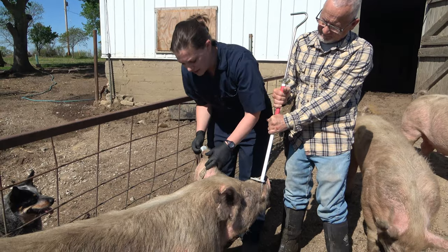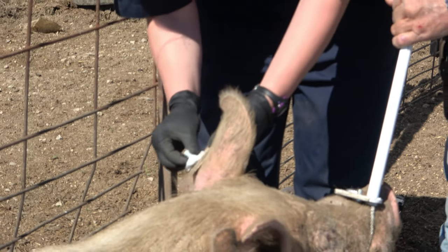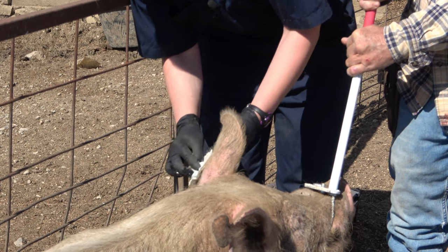All right, so we have this sow all snared up here. We're usually gonna do a 3-and-3 scrub on these guys, but pigs are a little bit dirtier, so we'll probably end up doing a little bit more than that with her, but that's okay.